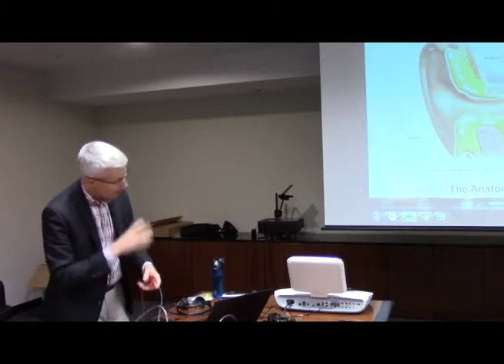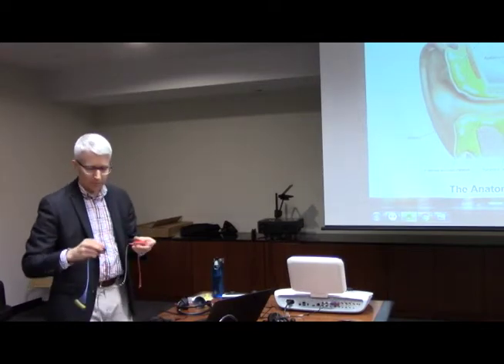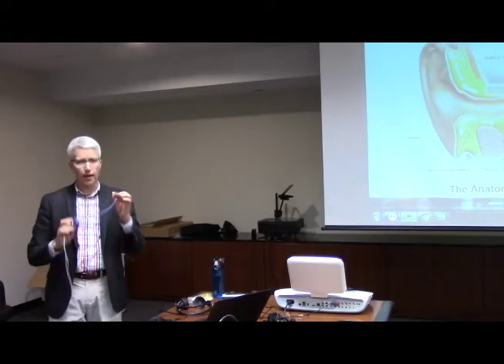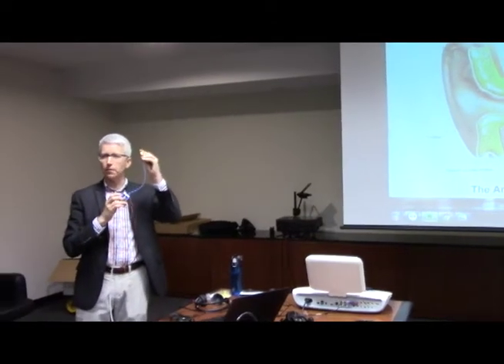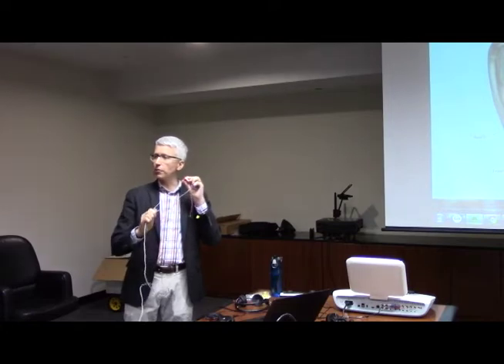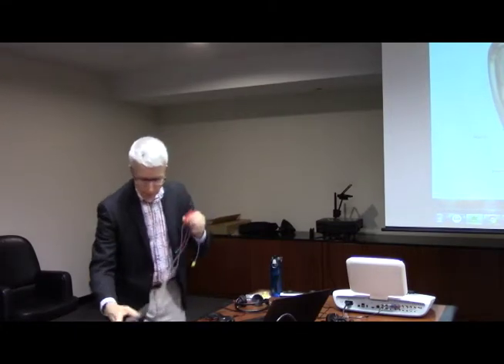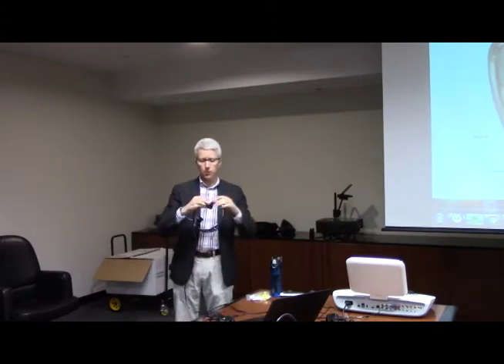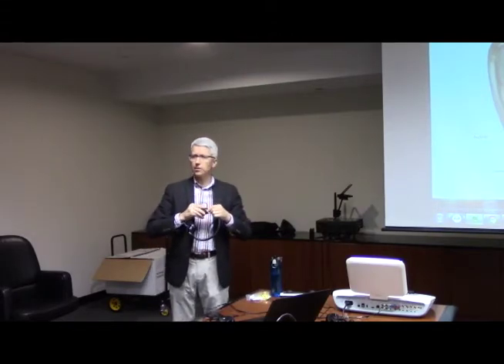As an aside, kind of stepping away from the actual testing part, something else that we quite often see: you've got a lot of different parts here. You've got the tip that I showed you. You've got the tubes that couple it. We sell those. You have the insert phones. We sell those. You have the cords, so if the cord goes bad, you can replace the cord on these. On the phones, cords are also replaceable. You have cushions. A lot of times you'll see cords and cushions.